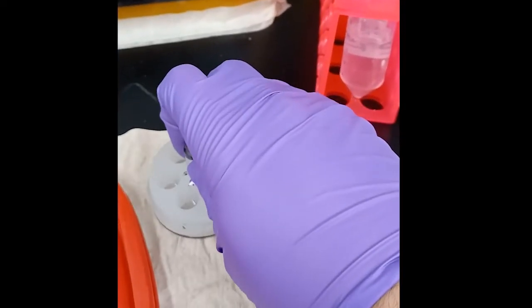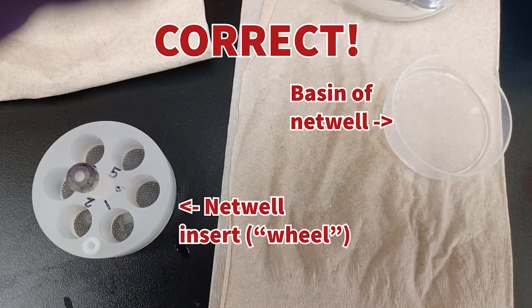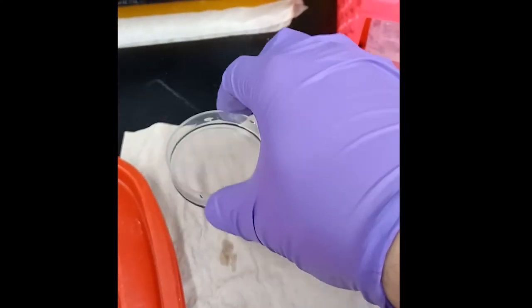Now, for each of the net wells, separate the netted insert wheel from the clear basin as shown here. Place the netted insert on the counter, not on a paper towel. We do not want to dry these netted inserts out. Pour the solution of these basins into their appropriate tubes.